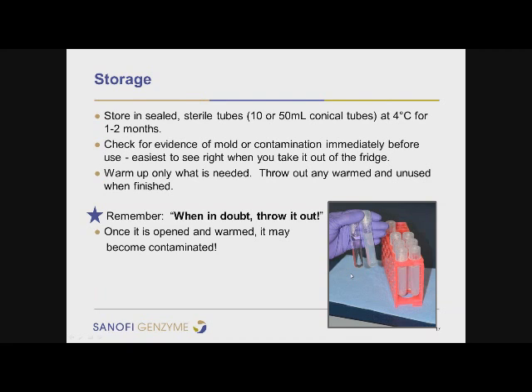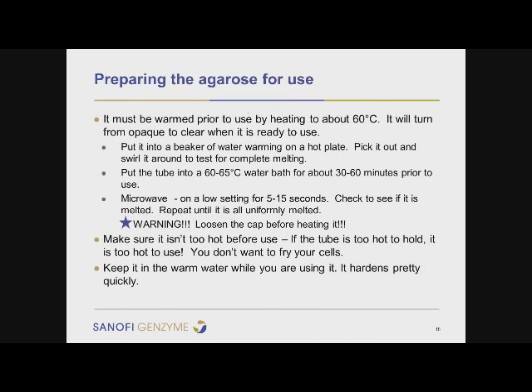And I'm very careful that when I'm performing the procedure itself, I only warm up what I need and throw out any warmed and unused material when I'm finished. Remember, when in doubt, throw it out. Once it's opened and warmed, it may have become contaminated, so it's better to throw it out than to have to go all the way back to the lab and start over collecting more tissues.